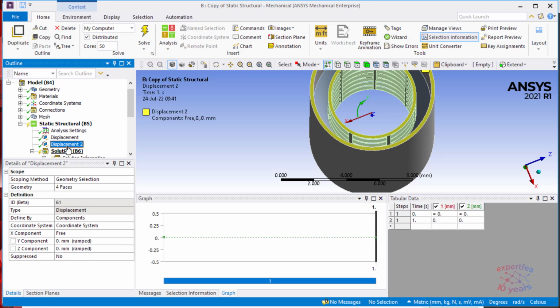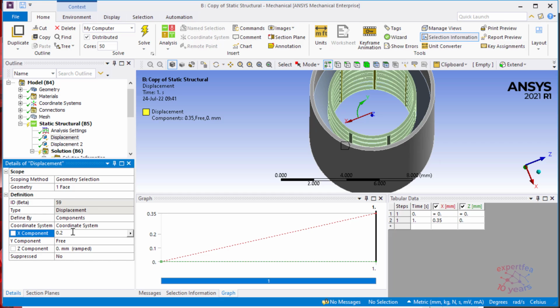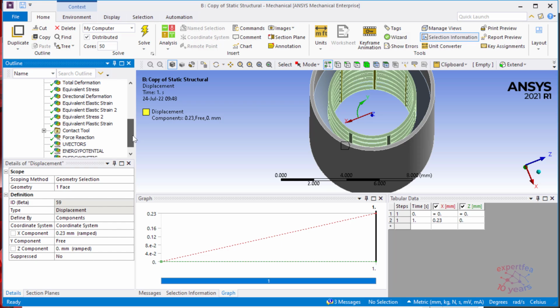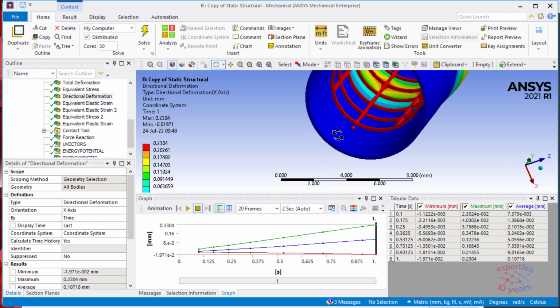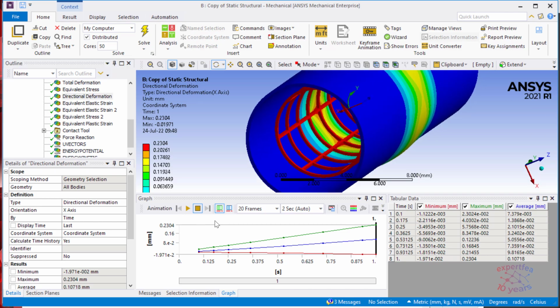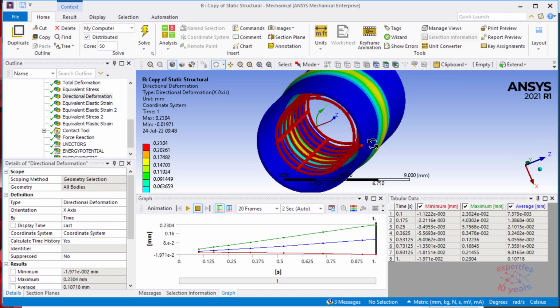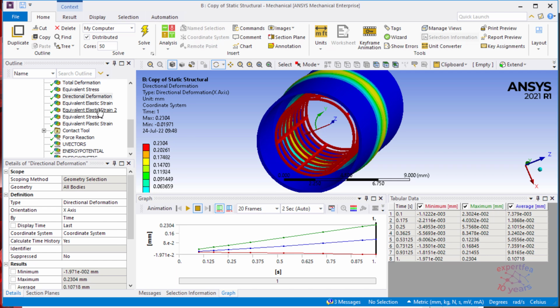So this one maybe 0.23, save and solve. I will return when the FEA is finished. So the FEA just finished solving. Let's see. So we're going to check the radial displacement. Of course, as we prescribed 0.23, it is given here.